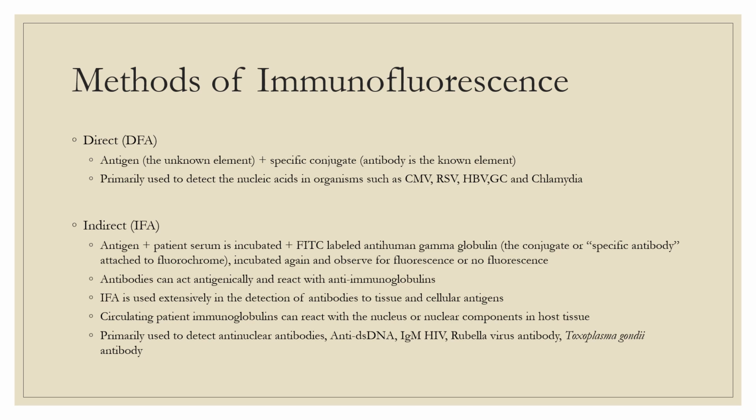So in the direct fluorescent antibody test, we take the patient's sample, we put it on a slide, we add our FITC, and then we allow it to incubate. After incubation, we wash the slide, and then we observe it using a fluorescent microscope. Anything that fluoresces green indicates a positive test for whatever analyte we're looking for.